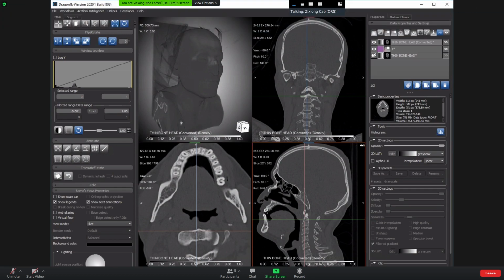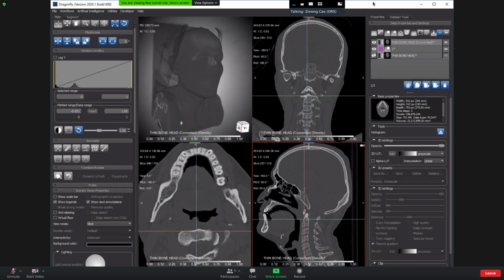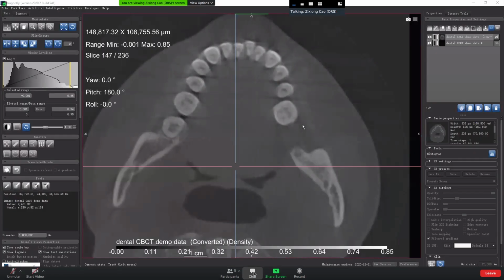So for your next patient scan, you need to do the same thing. If you want to train a new model on the other patient, or if you want to apply the model you trained on this patient to another patient, you need to do the same normalization. Okay. Yeah. Thank you. You're welcome.